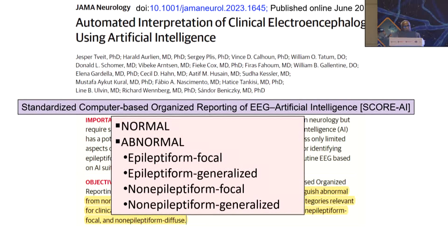So the conclusion was that artificial intelligence can considerably reduce the duration by identifying whether the EEG is normal or abnormal. But whether that abnormal pattern is correctly identified, whether it conforms to the patterns which we know as helping in the diagnosis, the answer at present is no.